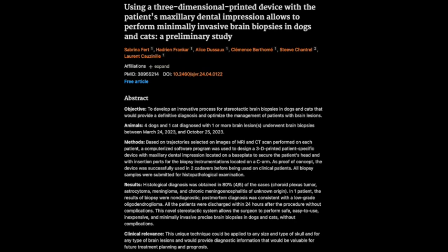And it seems like those removable guides on the C-arm ports add another layer of safety. Definitely. They provide precise control over the depth of penetration for both the trephination pin and the biopsy needle. So they've really thought of everything to make this procedure as safe and effective as possible.